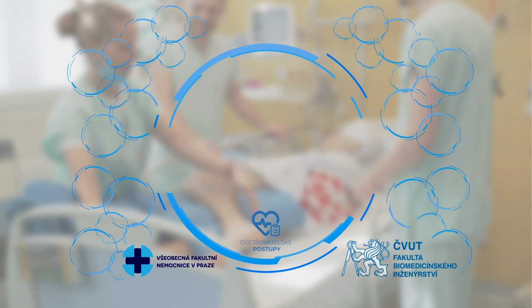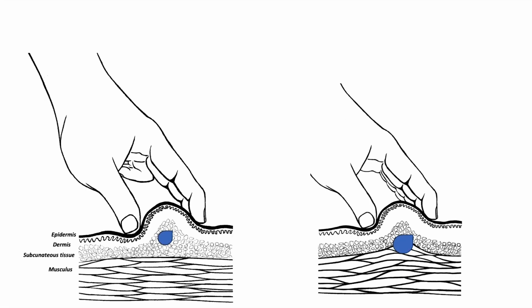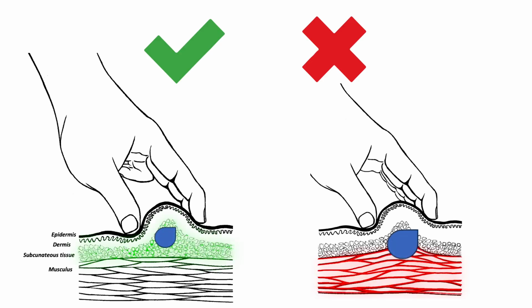Insulin administration. Insulin, a key peptide hormone, allows cell structures to absorb glucose and regulates blood sugar levels. It is administered to patients with diabetes. For optimal effect, it is crucial that insulin is injected into the subcutaneous fatty tissue and not into the muscle beneath it. Injecting insulin into muscle tissue can cause severe hypoglycemia.